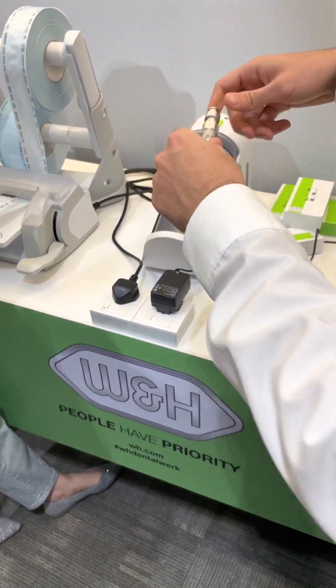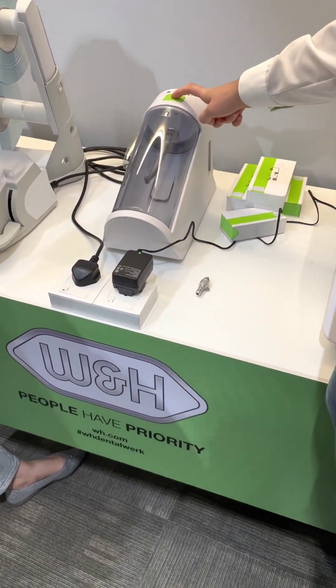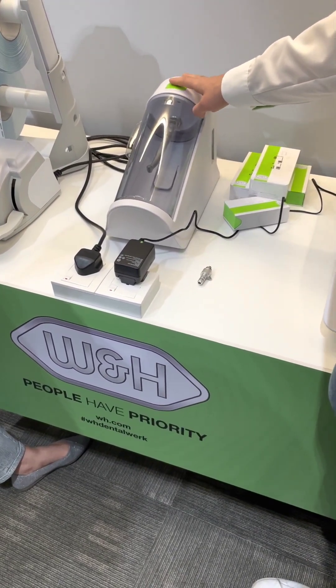Place the end pieces, close it and press the button. Nothing more to do — 18 seconds.